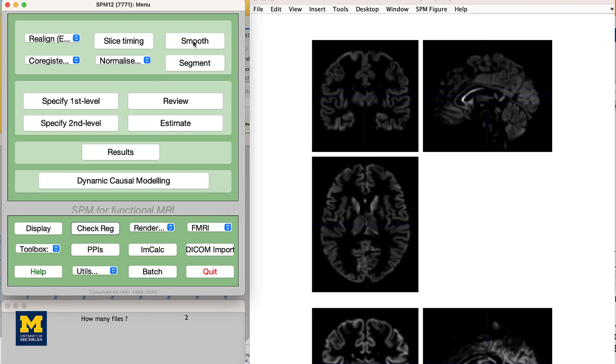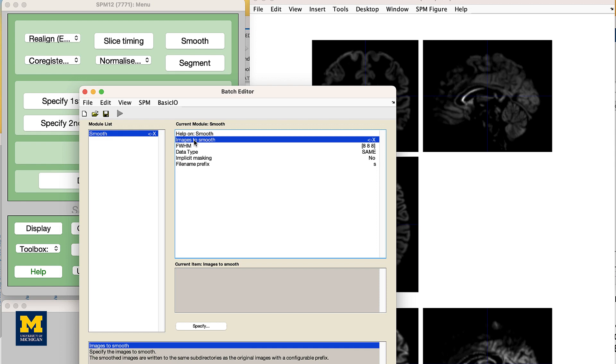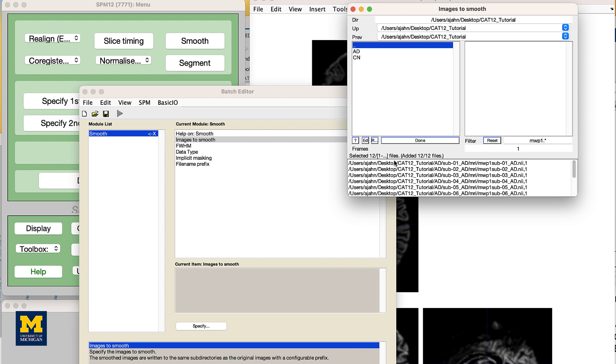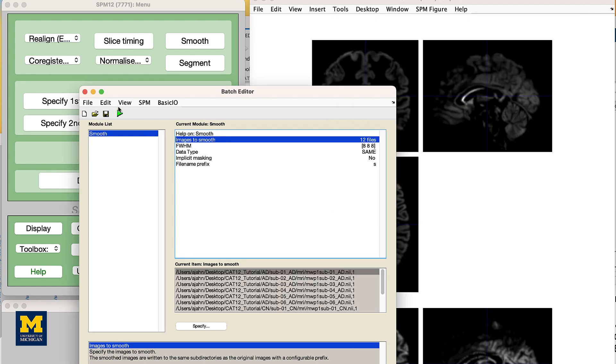The CAT12 manual recommends a smoothing kernel of 6-8 mm. For this tutorial, let's keep the default values of 8x8x8. Then, double-click on Images to Smooth and, as before, navigate to the CAT12 tutorial directory, enter MWP1 in the filter field, and click Rec. Then click the Done button and click the green Go button. This should only take a few moments.